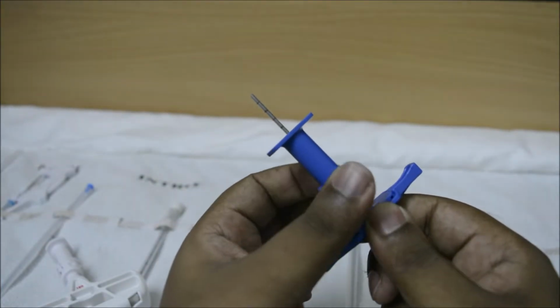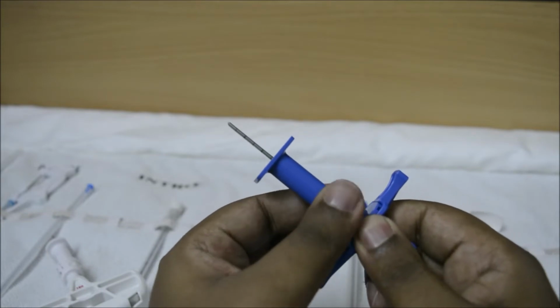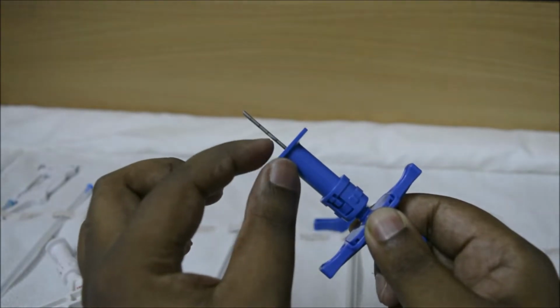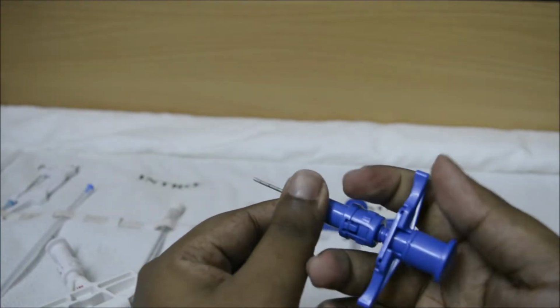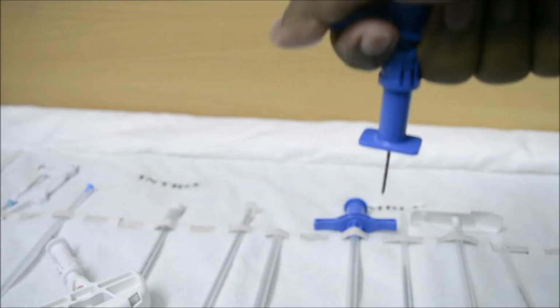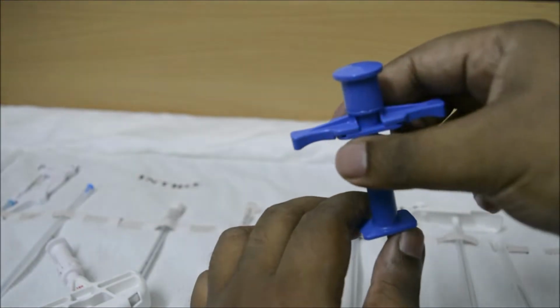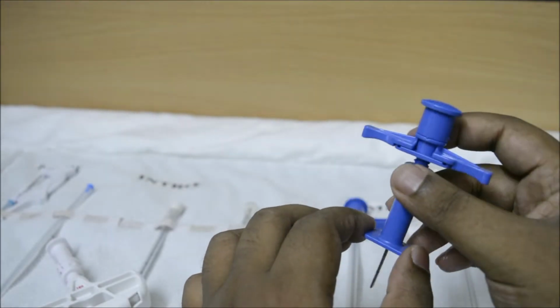So for example, the doctor wants to insert 5 centimeters into the patient's body. So these are 5 different marks, 1, 2, 3, 4, 5. So 5 centimeters will get inside. Now the doctor holds the needle upright like this. He first identifies under the scan where he wants to insert the needle. It is either in the sternal crest or in the iliac crest.